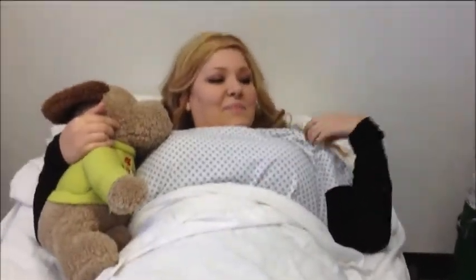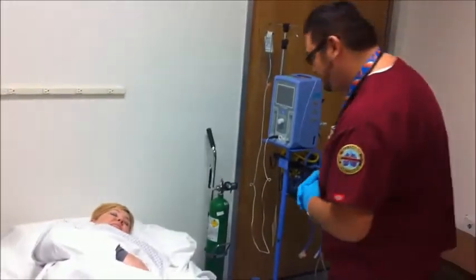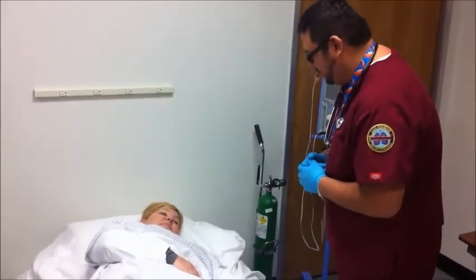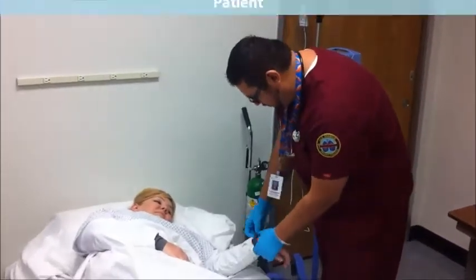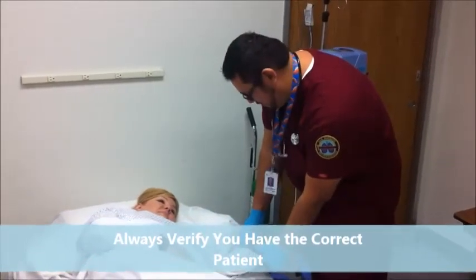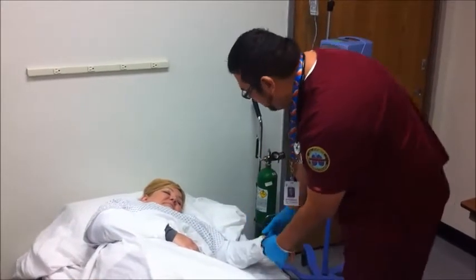Come in! Hi, my name is Joe, I'm from the RT department. This is Cawthorn. Hi, how are you doing today? I'm okay. I can't breathe. Can't breathe? Well, first let me go ahead and check your wristband real quick. You always want to verify that you have the correct patient. Can you give me your birthday please? 6/18/1939. Yep, everything seems to check out.